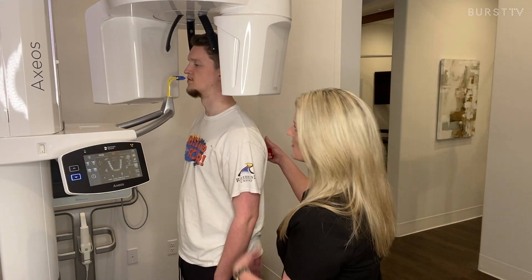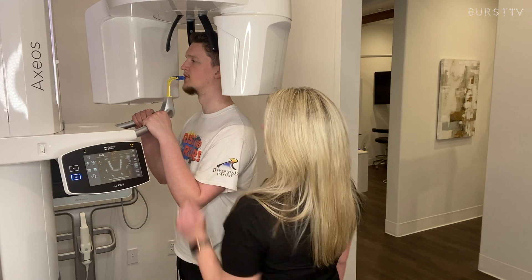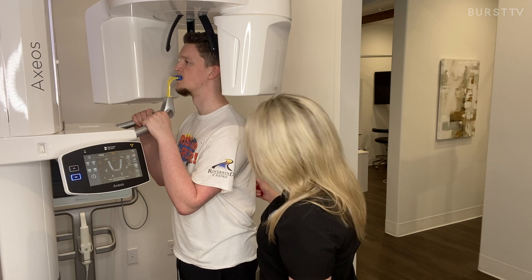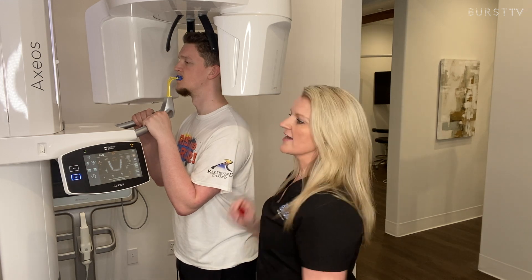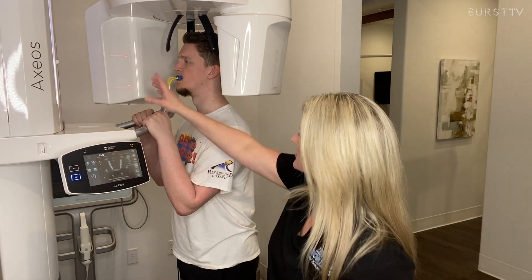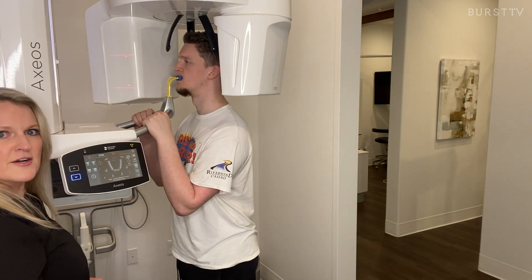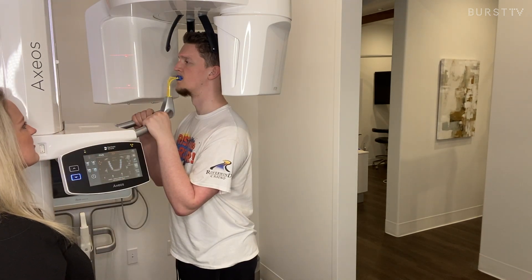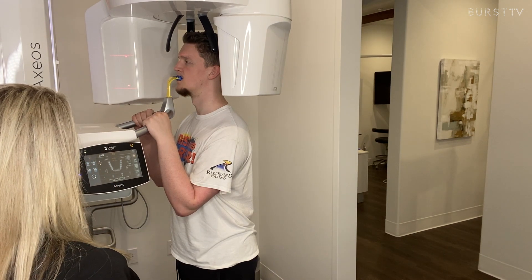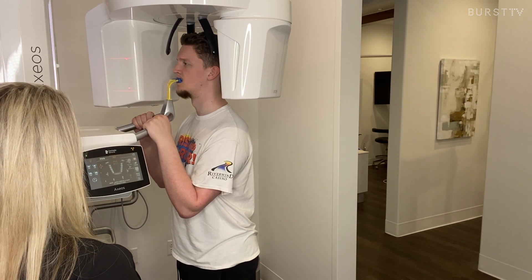Jamie will step forward and stand straight back, put one hand on each bar, and then I'm going to have you bite right down on that little piece of plastic — feel where that groove goes in your teeth. Are you standing straight and tall as you can? For this machine we're going to push this light button which turns on the lights. They have a mirror to see, so if you'll align that straight down the middle of your nose. I'm going to lower this down for you just a little bit. We want them standing straight and tall but we don't want their chin to be too far up, because we want to get exactly the anatomy we like.